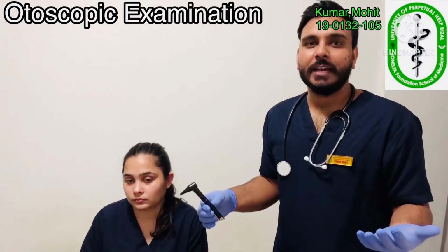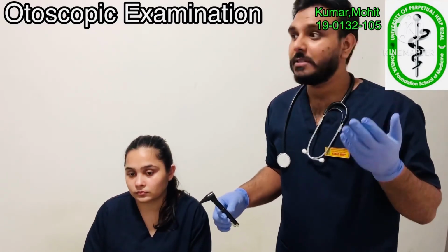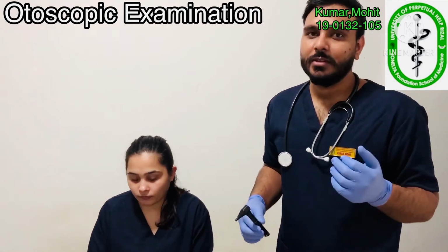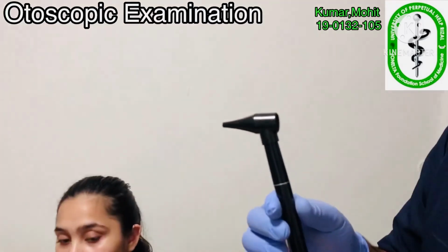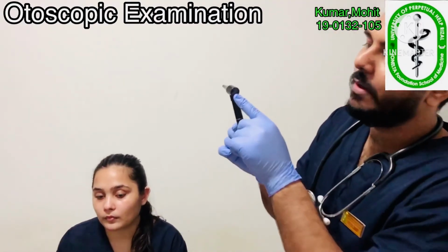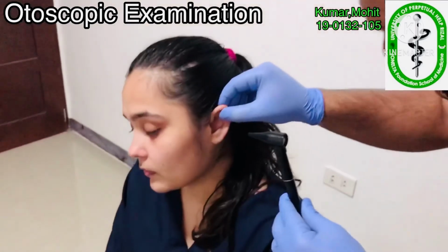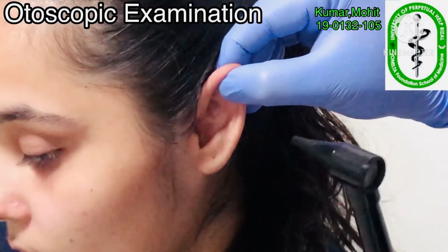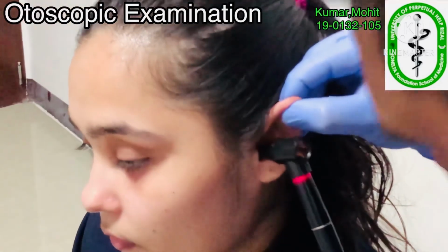Now we are going for the internal structure of our ear, meaning the structures which are inside of our external ear. For that we should do the otoscopic examination. I have an otoscope here with me. We have to put it inside the ear of our patient and observe from this place. So let's get started. First of all, we have to pull the ear upward, backward, and outward. Put in the otoscope.